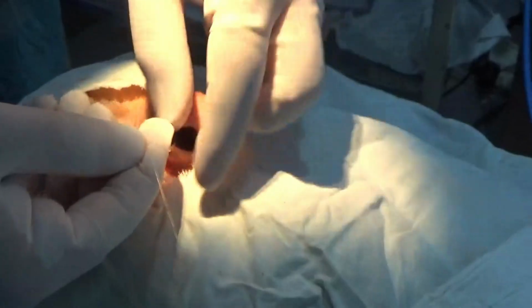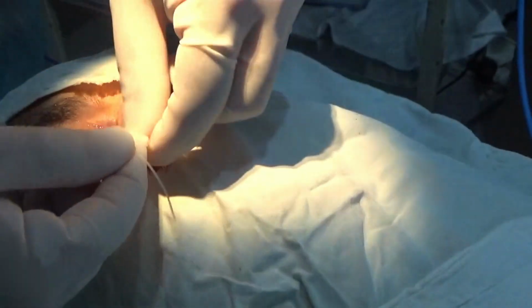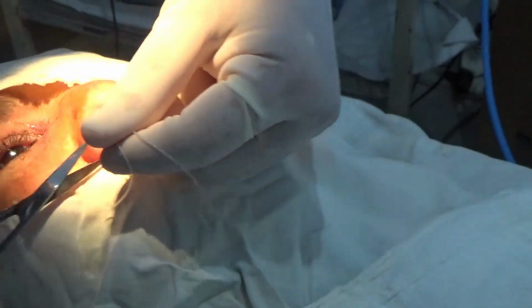Needles of the DCR tube are cut away and two ends of the tube are tied together by pulling the tube down. The extra tube is cut away and the knot goes into the nose. This tube is removed after 3 months.